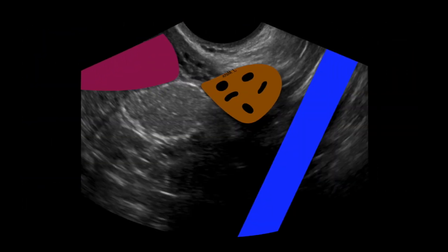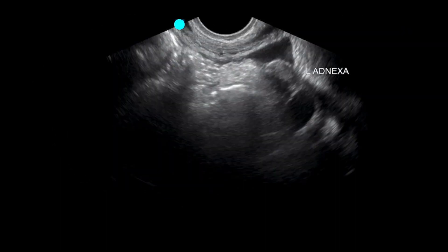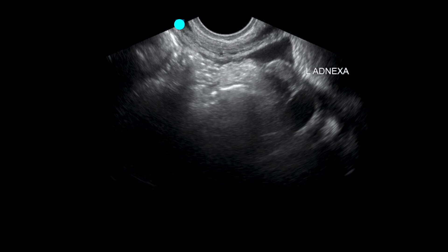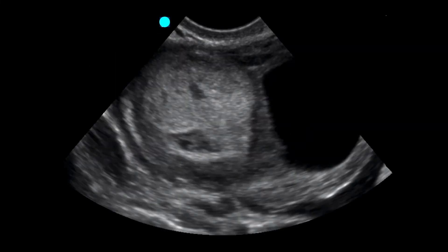After evaluating the right adnexa we shift over to the left adnexa, angling the probe while keeping the probe marker towards the patient's right. We may have some free fluid here, and there's a question mark over one anechoic area — it's likely the internal iliac vessels, though it's hard to tell with this cut. So what are we thinking? We've got a right adnexal mass with free fluid. We want to come back and look at the area of concern to make sure we're not missing anything. There was nothing in the uterus so there's no need to look there again, but we're going to evaluate what looks to me like an ovary with a complex adnexal structure — problematic in a patient with a positive pregnancy test and pelvic pain.